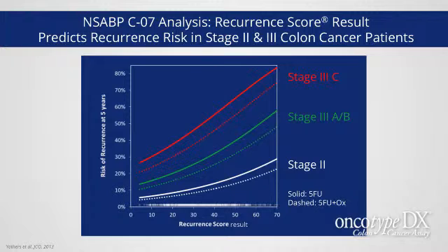Yeah, and you mentioned the good prognosis group in the CALGB study, and I think it's really important to point out that here's a good prognosis group based on the clinical and the histopathologic features, and yet the genomic assay was able to identify patients that you actually wanted to be more aggressive with and get the adjuvant therapy. And so I think it's very important that we highlight the fact that it gives you a better, more accurate assessment of risk than we can just looking under the microscope.